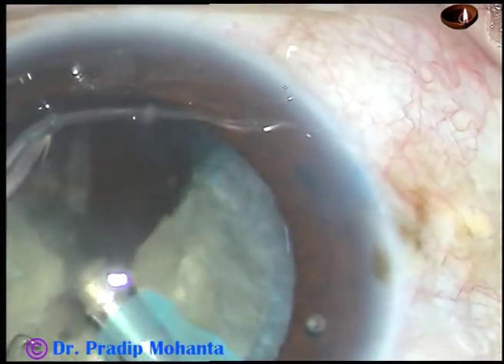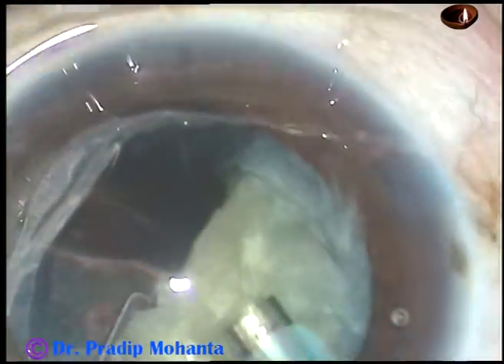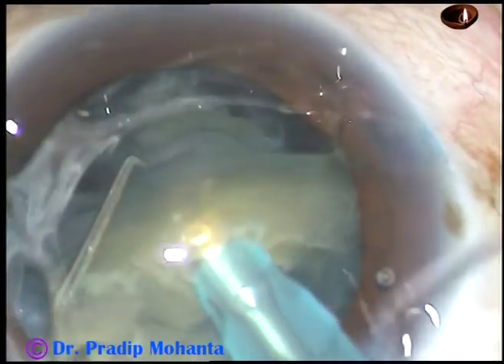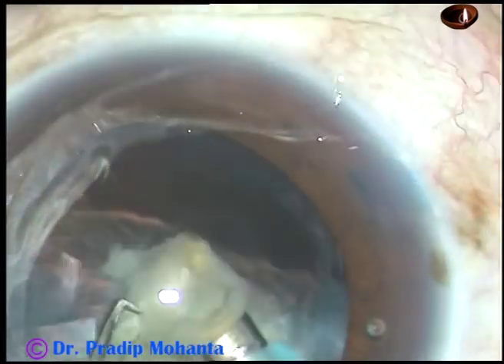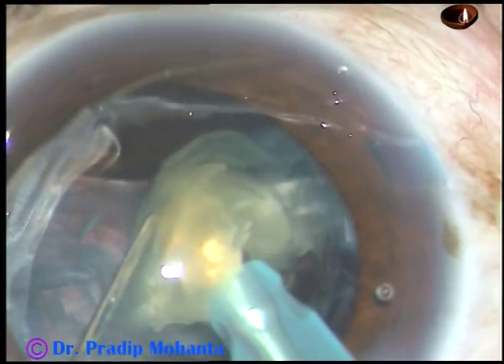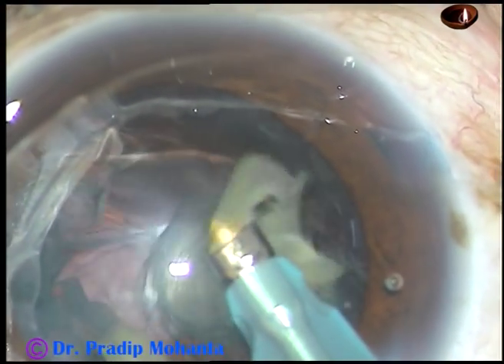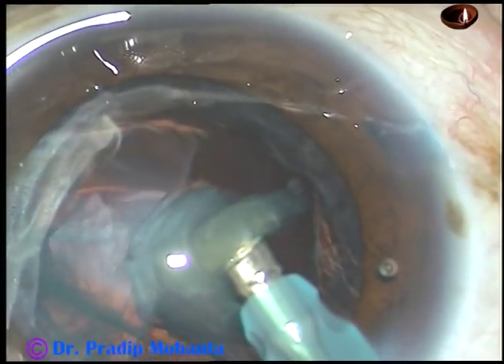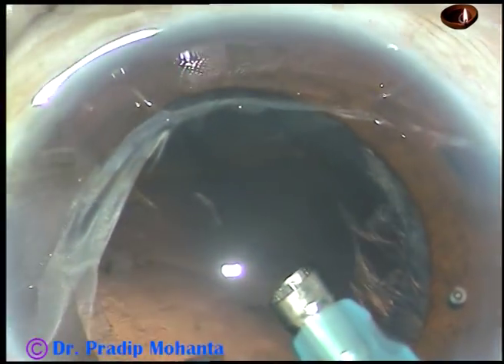Now each fragment is being emulsified. See how the pieces are being emulsified. This is the last fragment — the apex comes anteriorly and the equatorial region of the fragment rests on the posterior capsule. This is the last portion of the nucleus and epinucleus coming off.